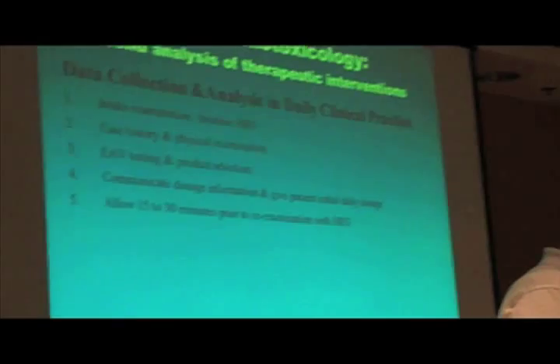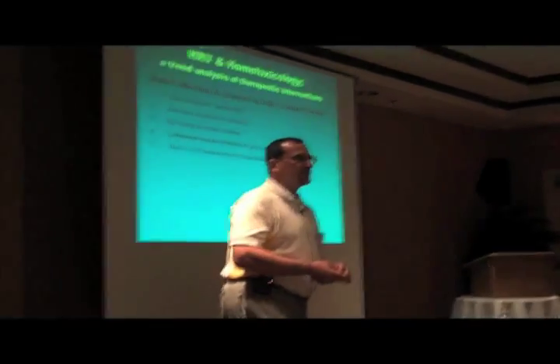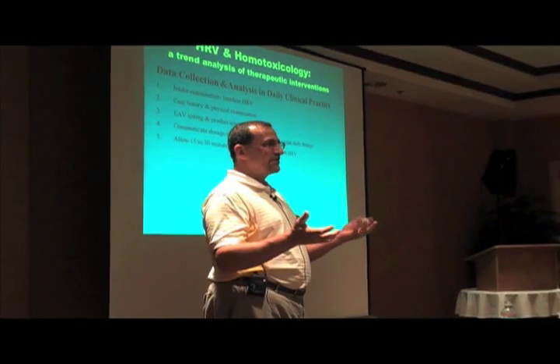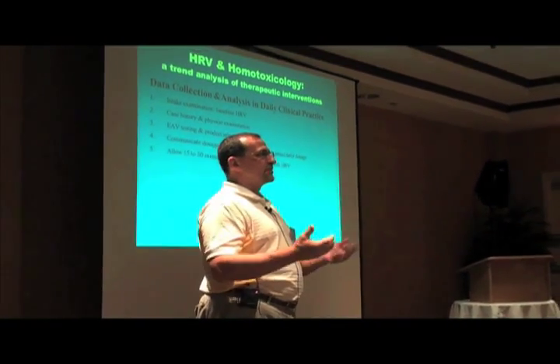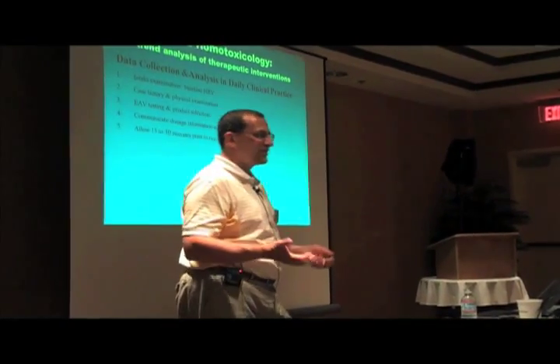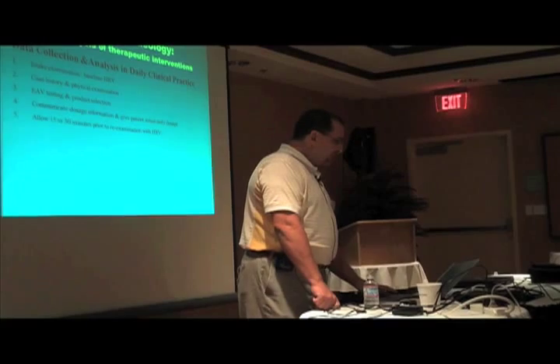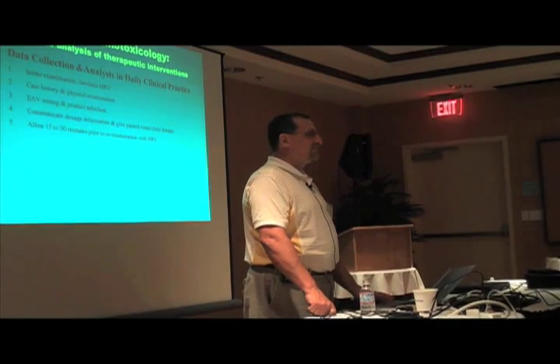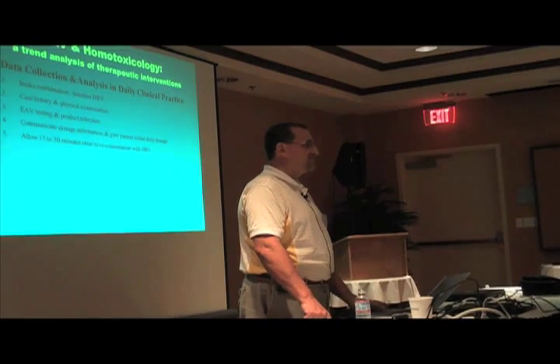We then allow anywhere from 15 to 30 minutes for the autonomic nervous system to react to the nutritional, antihomotoxic, or physical therapy — and then we re-examine with an HRV. That's how you get to do thousands and thousands of them; you do two or three on a patient when you see them.